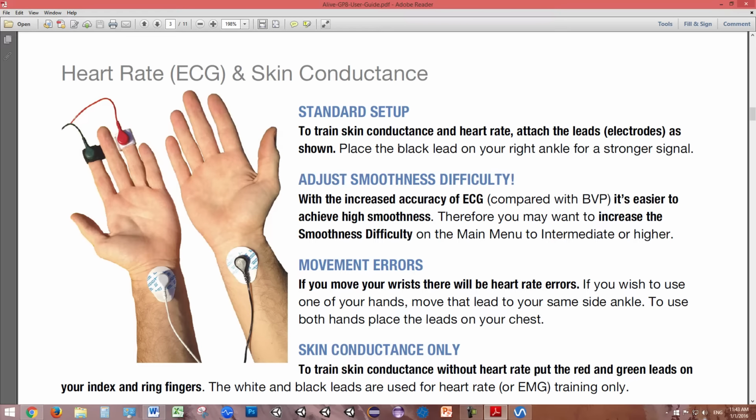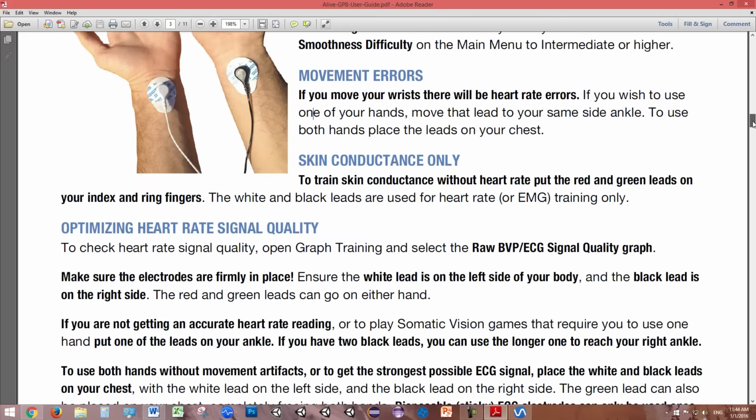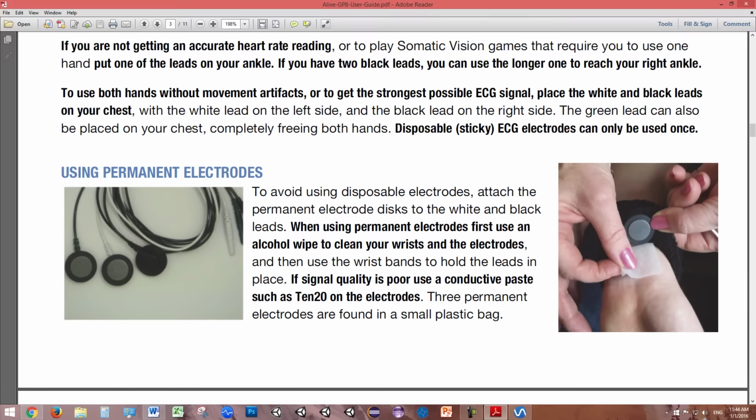You can measure ECG wrist to wrist, as shown here in the Alive GP8 user guide. You can use disposable or permanent electrodes. If you use permanent electrodes, wipe down the wrists and sensors with alcohol wipes first. Attach the permanent electrodes from the small plastic bag and hold them in place with the wristbands.